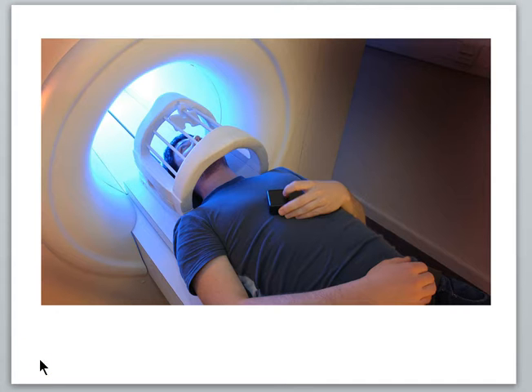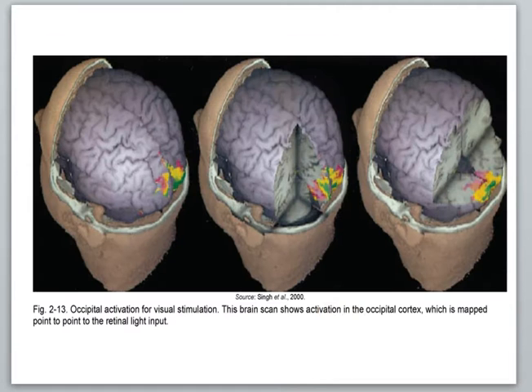In this lesson, we'll take a look at functional magnetic resonance imaging. This is a widely used technique in the neurosciences to measure the relative brain activity while people are doing different kinds of tasks. It produces an image like this, where you'll see this is a person looking this direction, and their skull is removed. Here we see the surface of the brain, the cerebral cortex, and a cutaway view of that. So the fMRI will give us a picture of the structure of the brain, but in addition, superimposed on that, these color splotches indicate relative levels of activity of certain regions of the brain.